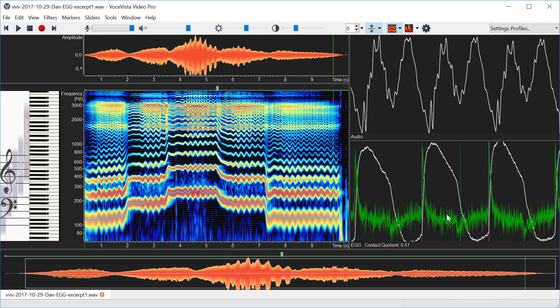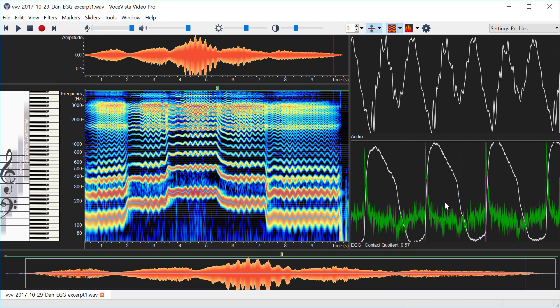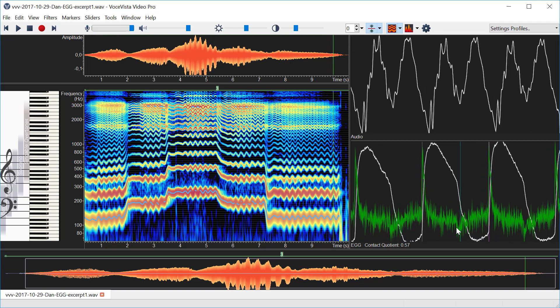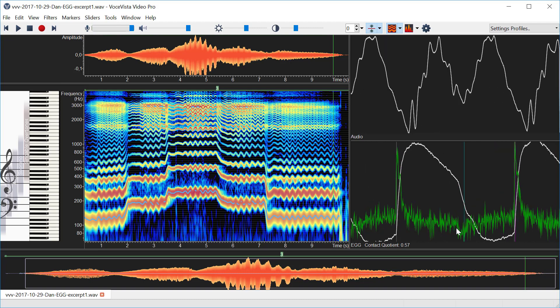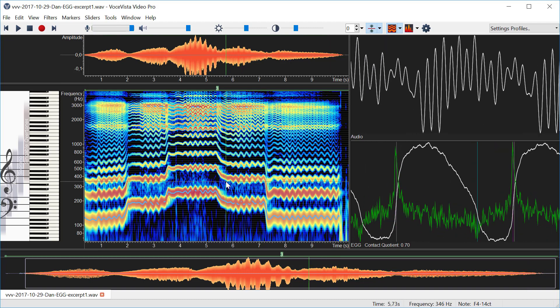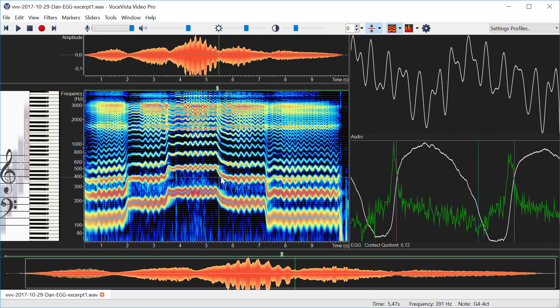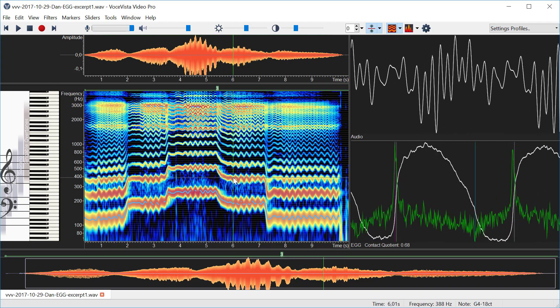And what we're interested in is the maximum and the minimum of this within one period. And you can see there's a very faint magenta line here to show the maximum and then there's this thin blue line to show the minimum. And this distance is what we use to calculate the contact quotient.